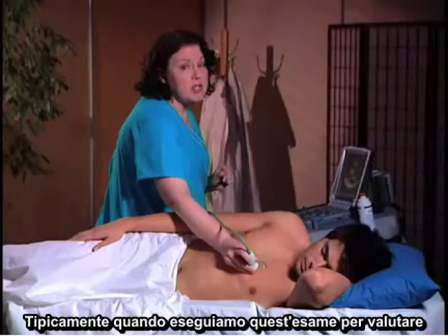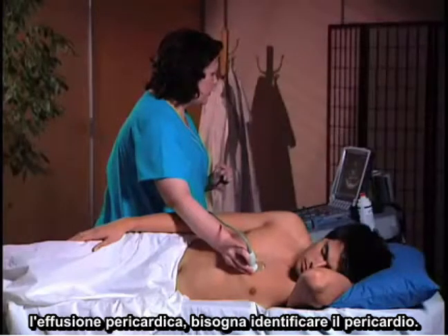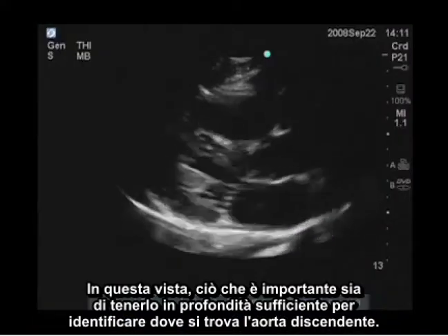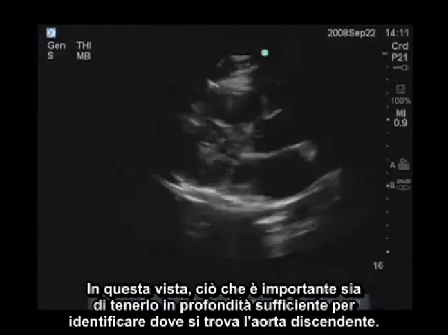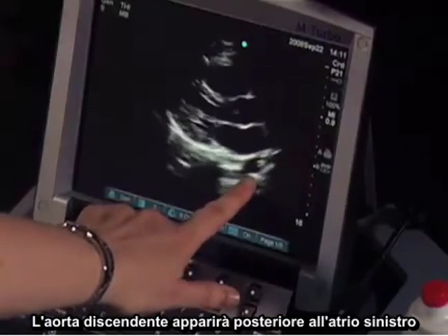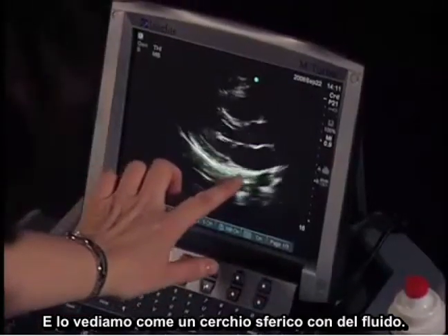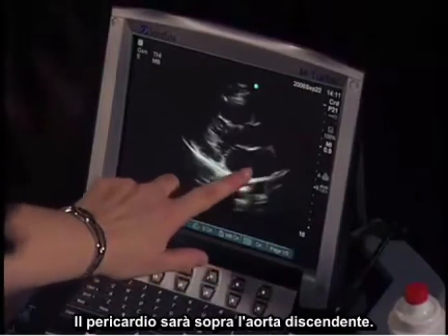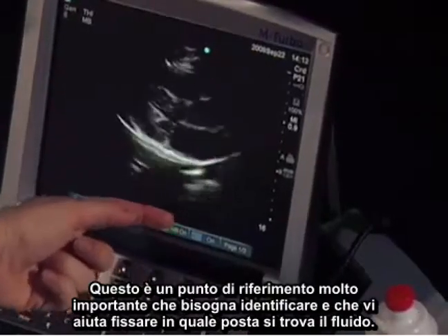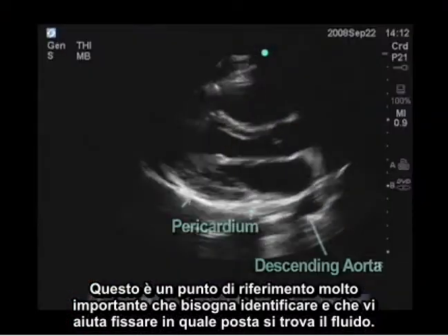Typically we're doing this examination to evaluate for pericardial effusion, so we want to identify the pericardium — this bright white line around the heart. It's important in this view to have it deep enough to identify the descending aorta, which appears posterior to the left atrium as a round circle. If fluid is in the pericardium, it will be above the descending aorta. If it's a pleural effusion, it will be behind the descending aorta. This is a very important landmark to clearly establish where the fluid is present.